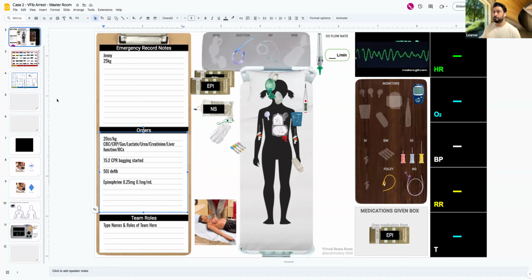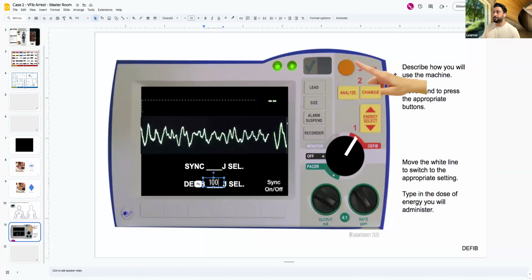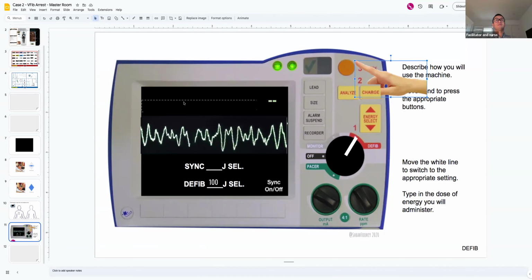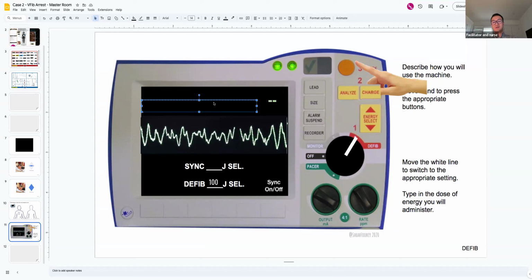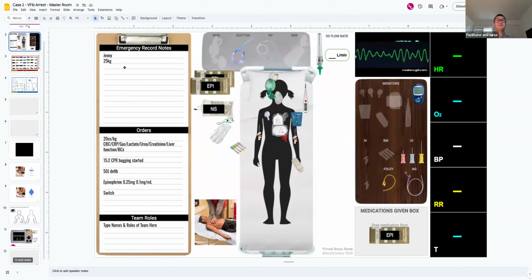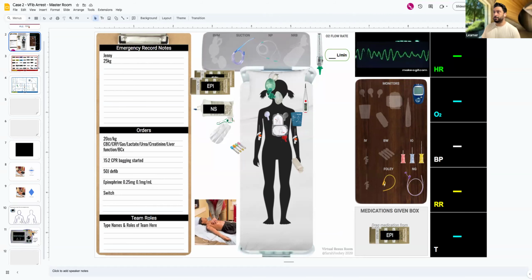Okay. And team, please stop compressions. I'm clear. You're clear. Oxygen's clear. Deliver shock. Okay, shock is delivered, and resume compressions. Perfect. I'm assuming my rhythm is what I'm seeing on the monitor, correct? Yep. Perfect. Okay, and we're continuing CPR.